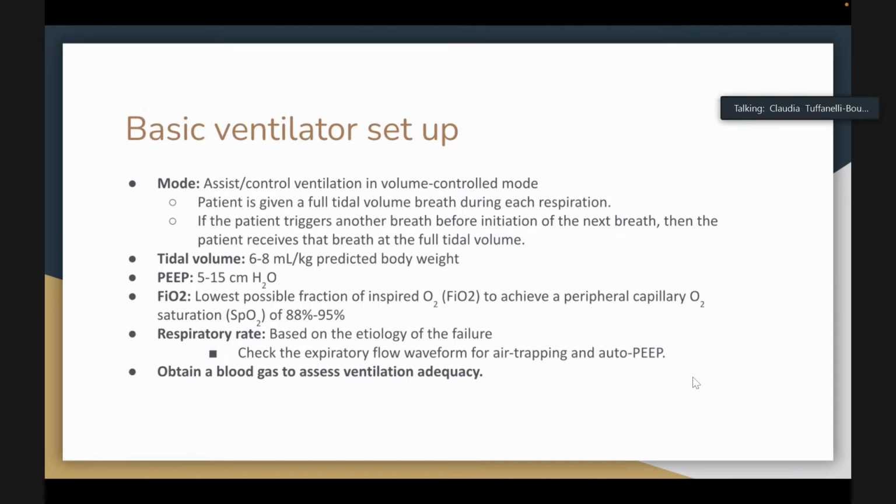Any patient can tolerate it. If they're not breathing over the vent because they're altered, it's fine. But if they have a metabolic acidosis from, say, DKA or some other process, this way you're going to get all the breaths they need, and their body is going to allow that, and it doesn't fight them too much. And I think it's more comfortable for the patient.